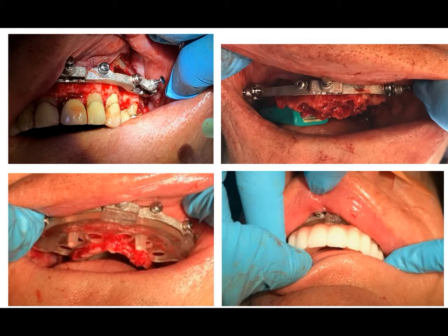The fixation base has been seated, and anything above the fixation base in the maxilla below is going to be reduced. So that's the bone reduction line, and the bottom left image is the carrier guide that's seated early just to make sure bone reduction has been achieved. The carrier guide can be removed and reseated until bone reduction is 100% accomplished. And on the bottom right side, the prosthetic can even be seated just to ensure that the occlusion is correct.